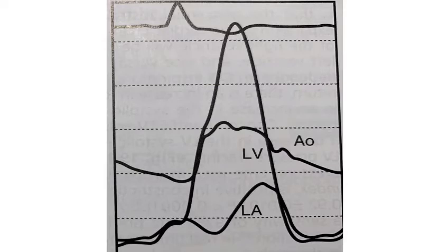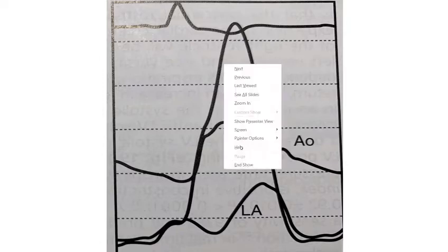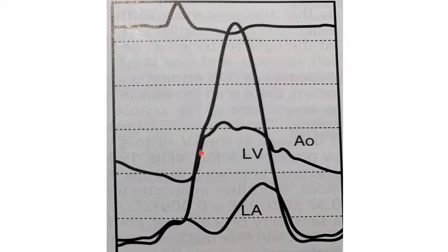What happened? Sir, here, in the aorta also, it has increased. Yeah, the aortic pressure is going up along with the LV pressure. So, at this stage, there is no? No gradient, sir. No obstruction. Then suddenly the obstruction comes. So, it's a dynamic obstruction.